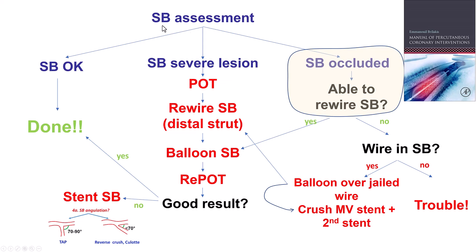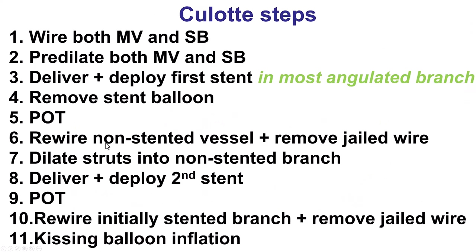The diagonal looked worse, so we decided we should probably place a second stent. In this situation — a side branch with a severe lesion after bifurcation stenting of the main vessel — the next step is POT, which we did with a 3.5 mm balloon, then rewiring the side branch. It still looked significantly stenosed, so we proceeded with stenting the side branch. Different techniques can be used: TAP, T and protrusion, reverse crush, or culotte for angles less than 70 degrees. In our case, the angulation of the diagonal was less than 70 degrees with similar size of the diagonal and the LAD, so we decided to go with the culotte technique.